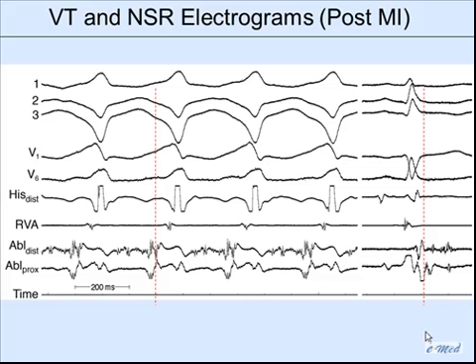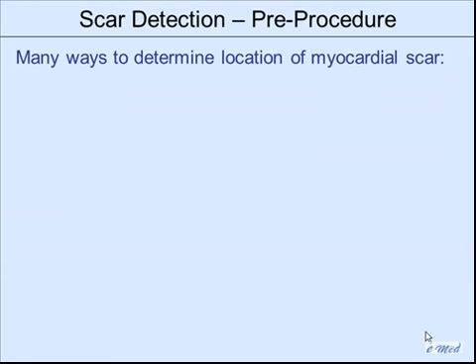Here's nearly continuous diastolic propagation here. This is an unusual case. But notice how just a few millimeters away, you don't see anything of that. Nothing of this prolonged diastolic propagation. That's clearly repetitive. It's clearly not an artifact. And here it is in sinus rhythm with this very strung out, typical in inferior infarctions.